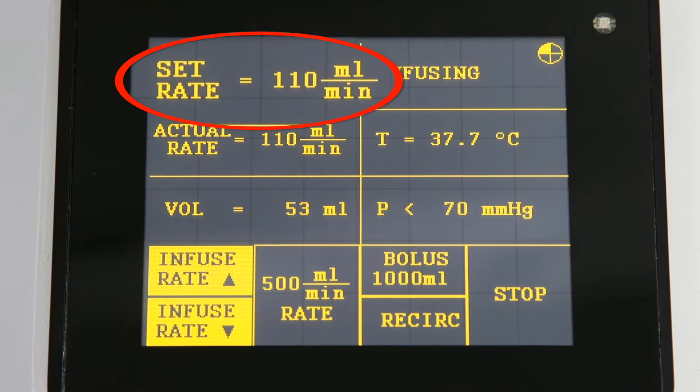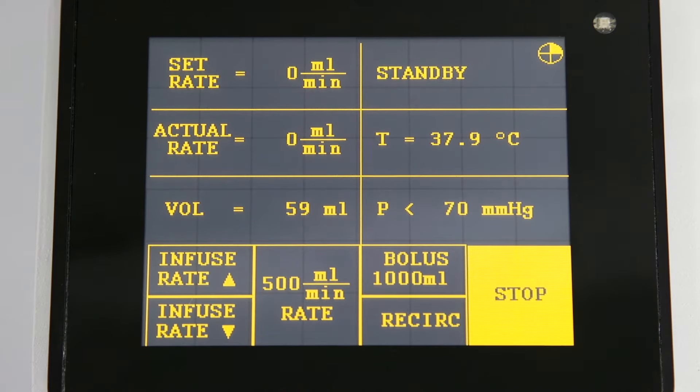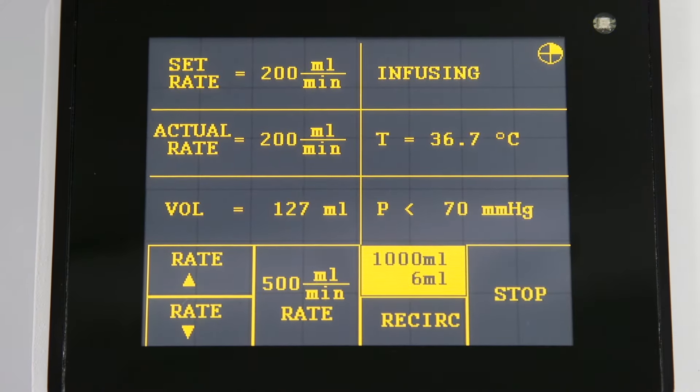Press and hold to change the rate quickly. Fluid will be precisely warmed at all infusion rates. You can press the stop button at any time. Pressing the bolus key will deliver a specific volume of fluid; the volume delivered will be displayed on the lower half of the bolus key until the bolus operation is complete.